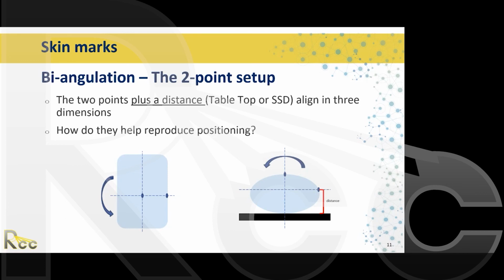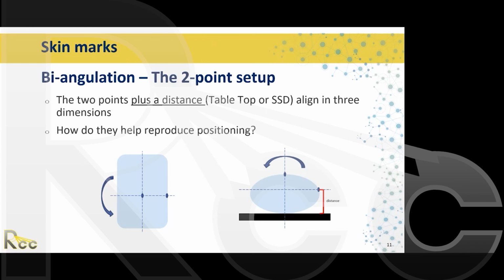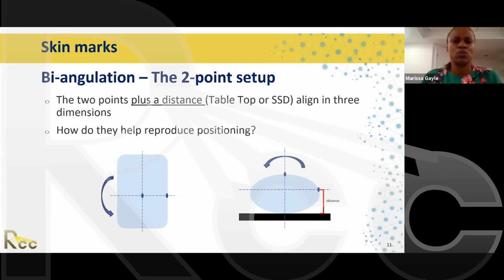And the last question is, does your clinic perform brachytherapy for cervical cancer? Yes, we do. And would you be able to give a quick summary of the role of the therapist in brachytherapy for cervical cancer? Our role is to set up the room and do the scan. For brachytherapy, our physician likes to make sure that the patients are pre-medicated, so the nurses will do that, and that they have a Foley. The nurses are going to do that.